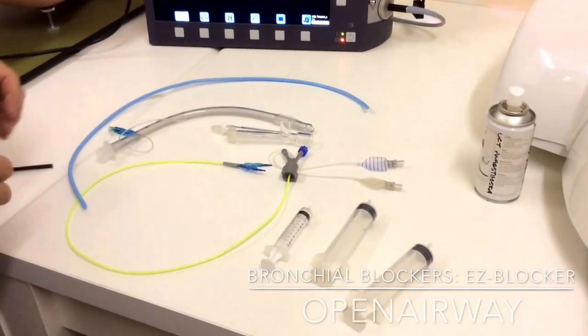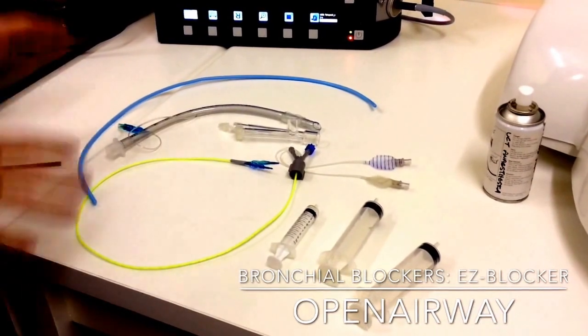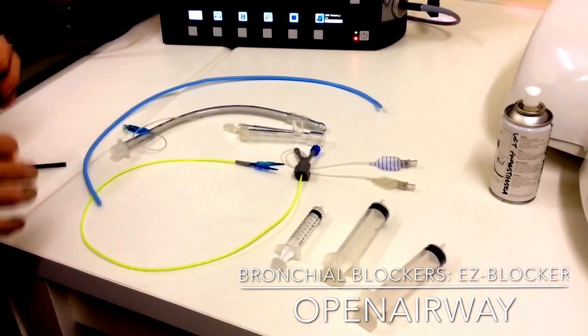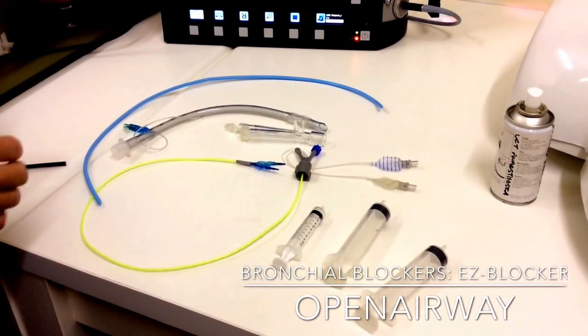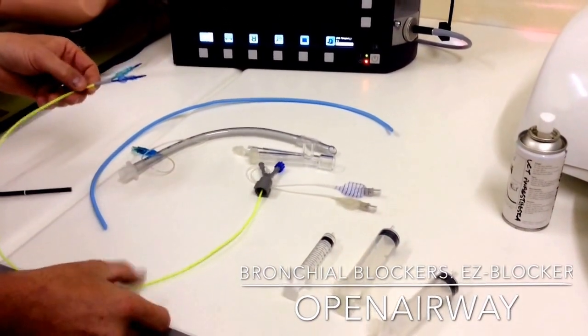Hi folks, Ross here from Open Airway. I'm in the UCT Anesthesia Airway Skills Lab and I'm going to do a quick video on the basics of how to insert an EZ Blocker, which is a bifurcated dual balloon bronchial blocker.